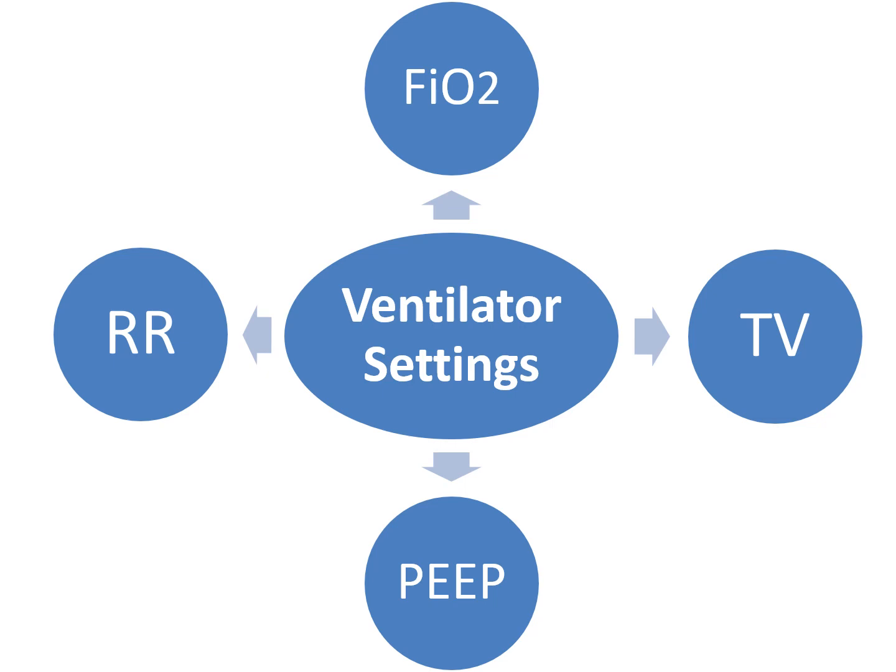The last setting is PEEP, positive end expiratory pressure. It is positive pressure maintained in the lungs throughout the expiration phase. This means when the patient has exhaled, they're still going to maintain a level of pressure within the alveoli, within the lungs. What that does is help the alveoli stay open. Especially with acute respiratory distress syndrome, ARDS, those patients have very stiff lungs, and every single time that you try to give a breath, those alveoli are very hard to open. So it's almost like every time the patient exhales, you have to start all over again.